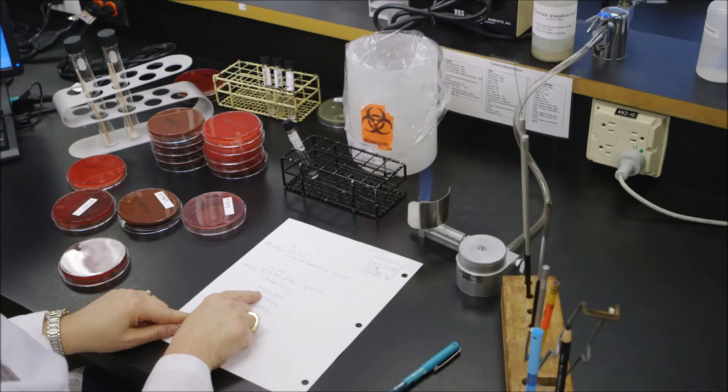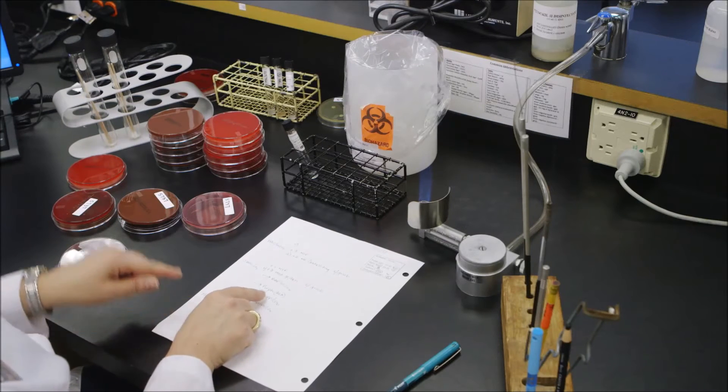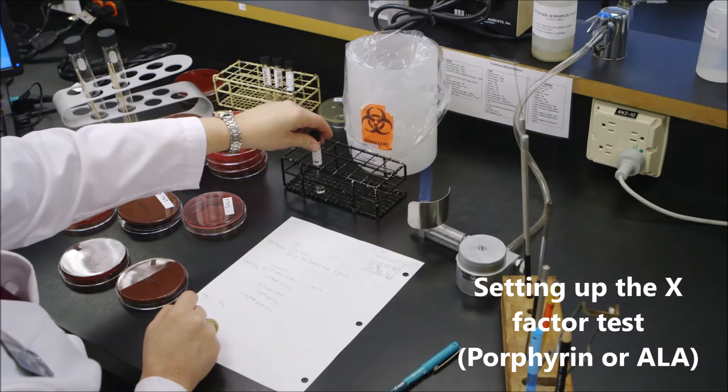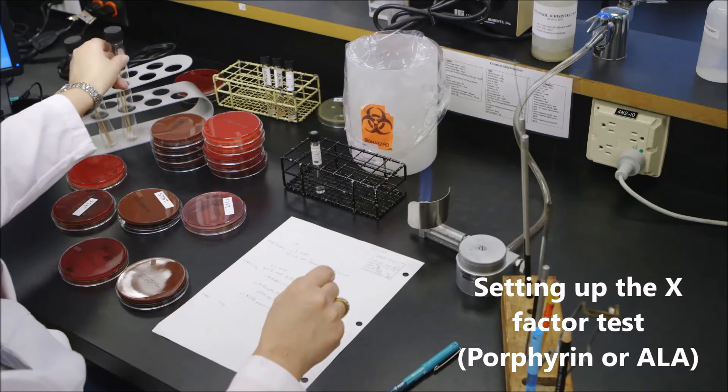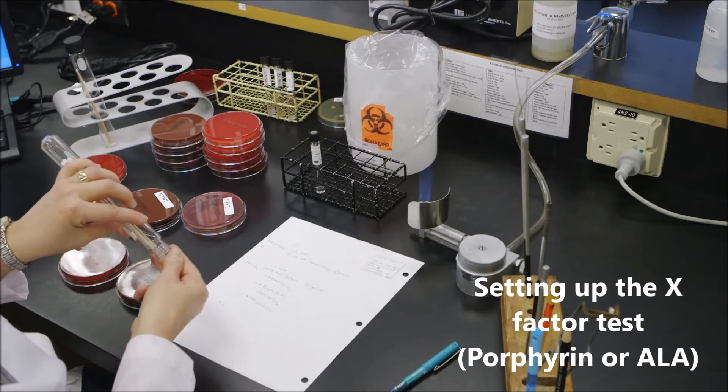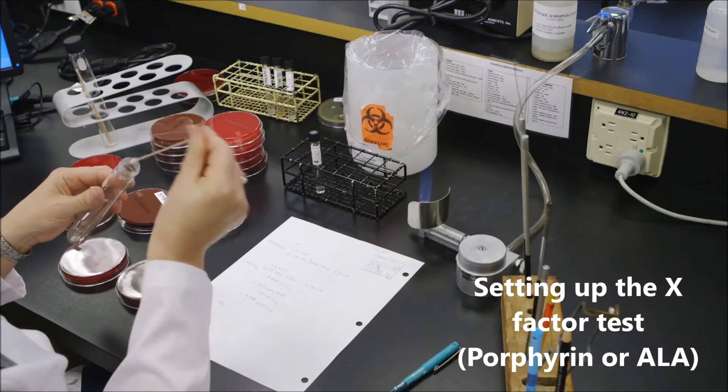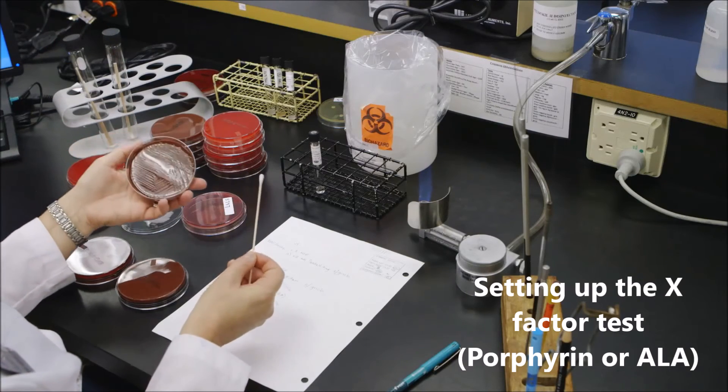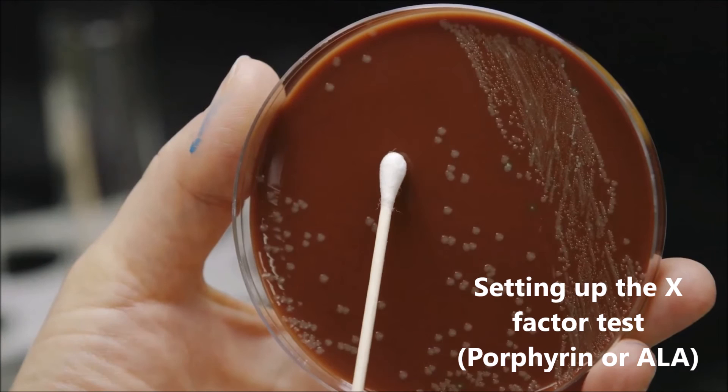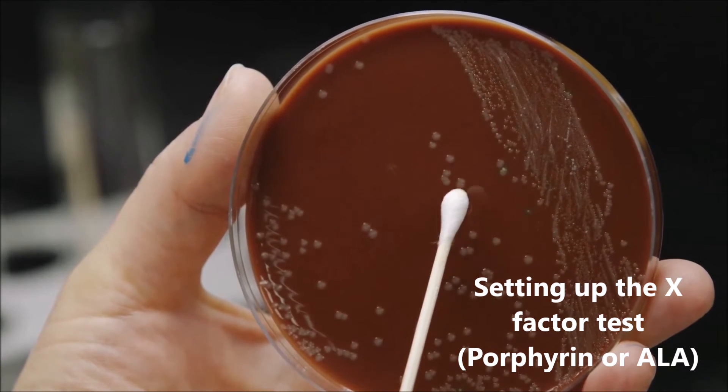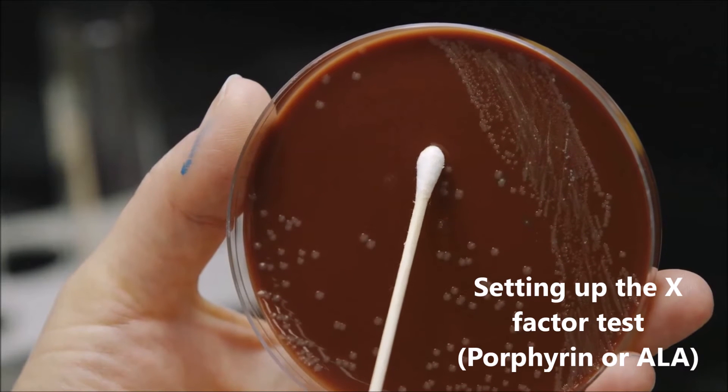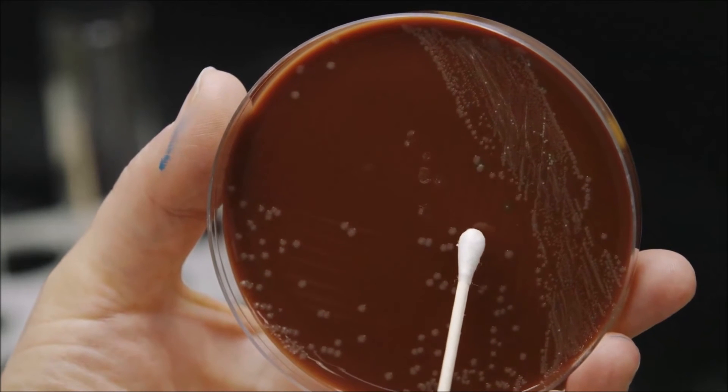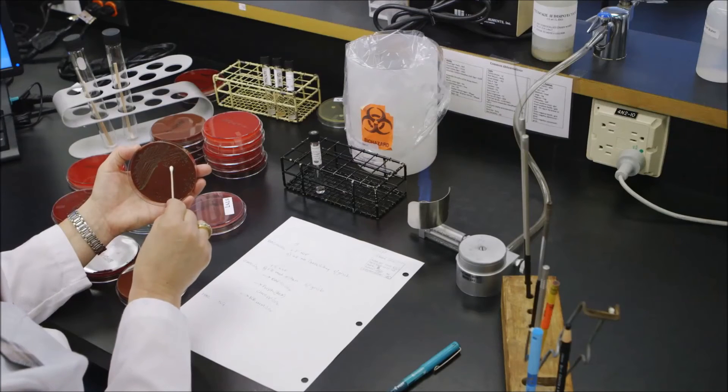The next test to do is the porphyrin with a chocolate plate purity plate. Porphyrin can be inoculated with a swab. It has to be a heavy growth, so you do need to take a few colonies. When you're using a swab, be very careful that you don't touch any other colonies on the plate that don't look like the Haemophilus colony.